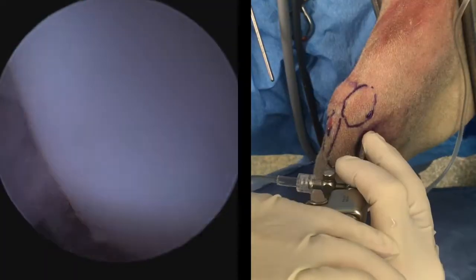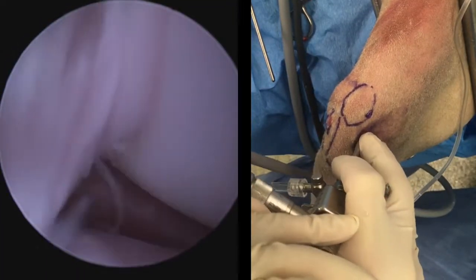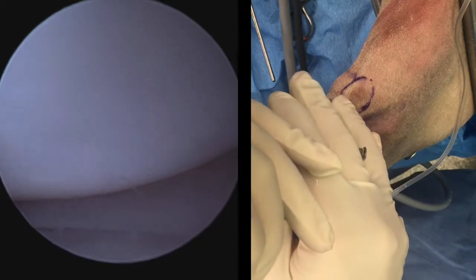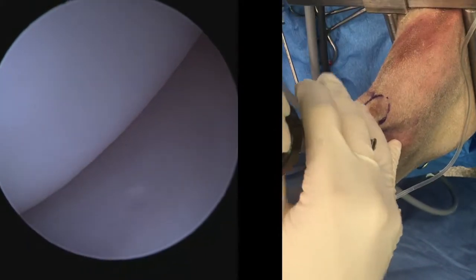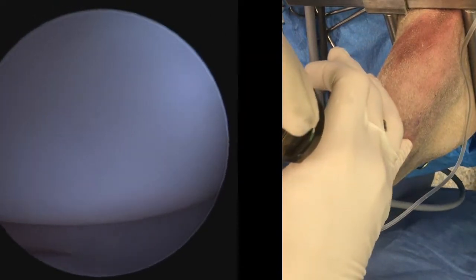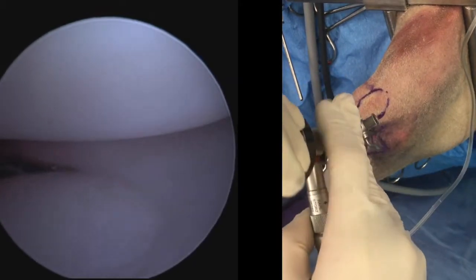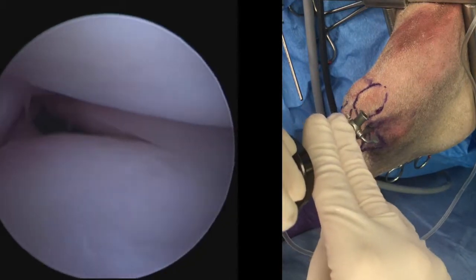We'll continue to drift our scope laterally, where we will fall into the lateral compartment. Here we can see the femoral condyle at the top of the screen, the intact lateral meniscus, and as we rotate the post around, we can get a better look at the axial regions of the lateral compartment and the tibial condyle.